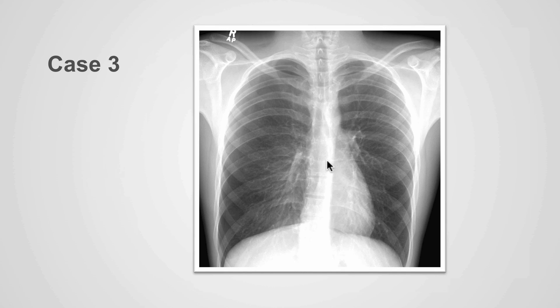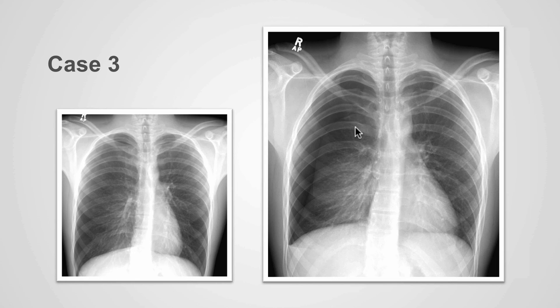Can you identify the pneumothorax on this case? Pause the video and take a look. In this case, we can identify a linear density extending superiorly, which represents the edge of the lung — this is the pneumothorax. The expiration view exaggerates the appearance of the pneumothorax on the right.